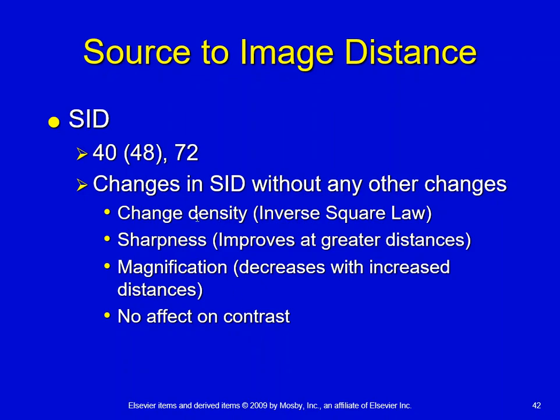Again, full disclosure, whenever you have a significant change in density, and you were to look at the raw image and compare the raw image, you might get the appearance of a change in contrast because you're going to have such a different change in density. So the overall image appears lighter, and to your eyes, in a lot of cases, it looks like a change in contrast, but it's really not.